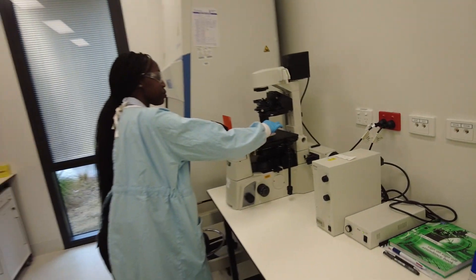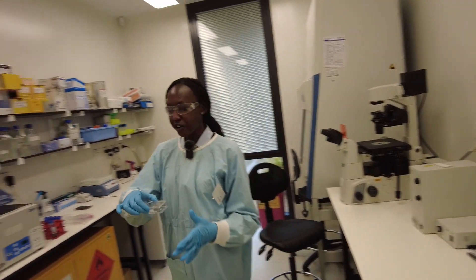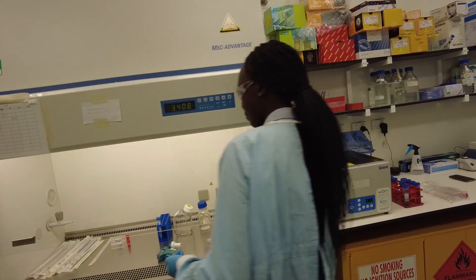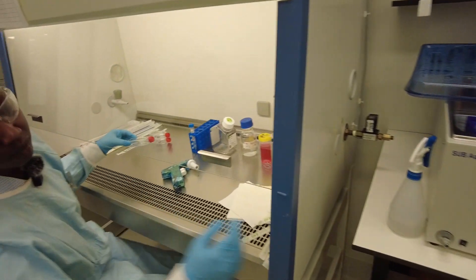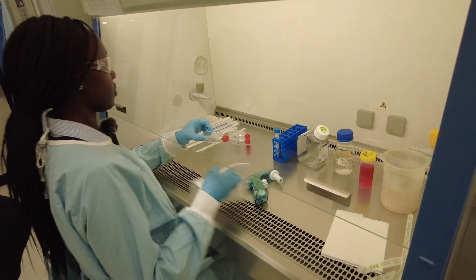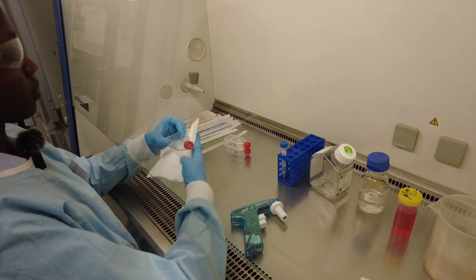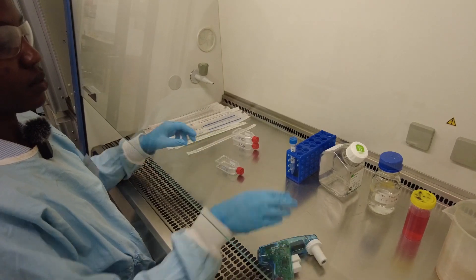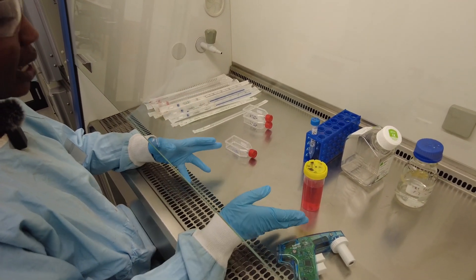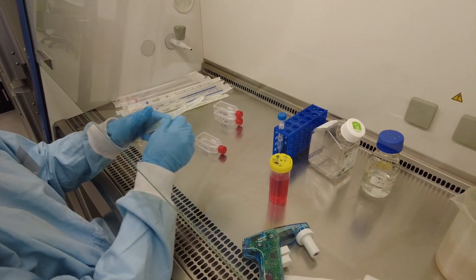So now we're going to add fresh media to neutralize what's going on so that we can spin them down in the centrifuge. We've added two milliliters of trypsin, so we're going to add two milliliters of fresh media so it's equal volumes.